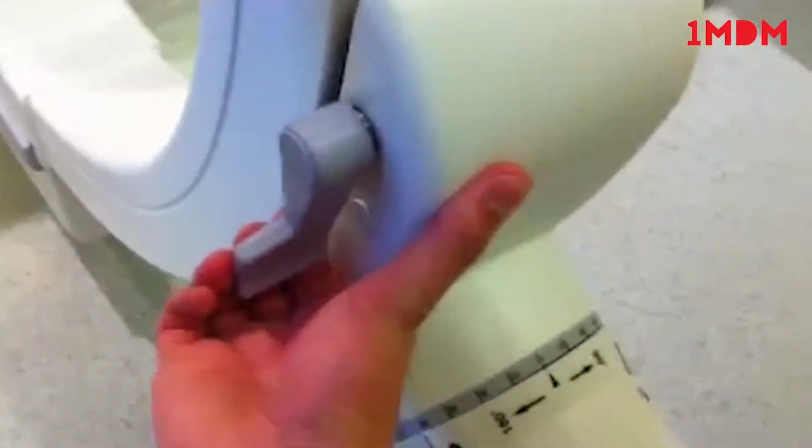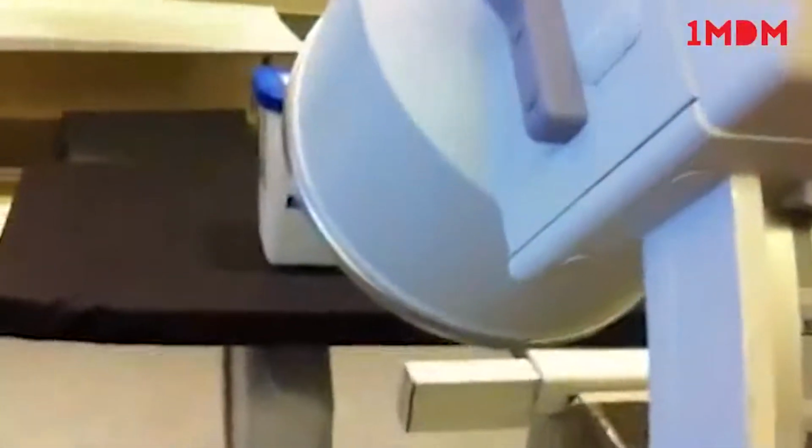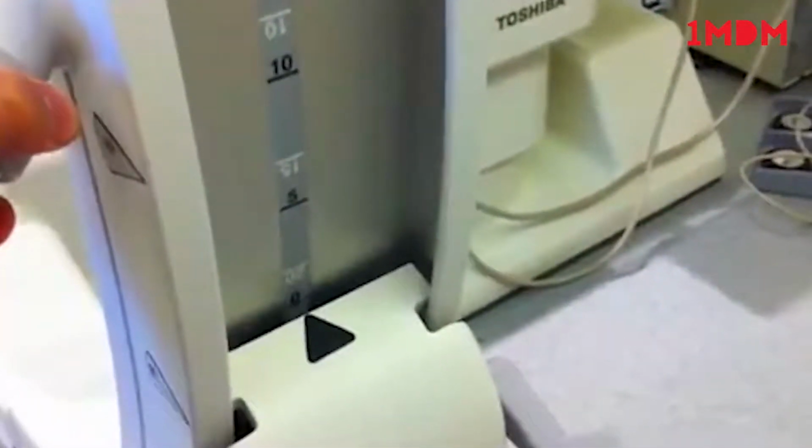All right. This lock over here, which you see right here on the C-arm, closest to the large C, this one is used to do angulation. Basically obliques or laterals. So of course, once it's unlocked, you can grab the handlebar here, and you can rotate this into a lateral position. I won't do this right now because it's going to hit the bottom of my table there. Something you have to watch out for. All right, let's return it back to 0 degrees. When you pass that point, it's right about there. Lock it.